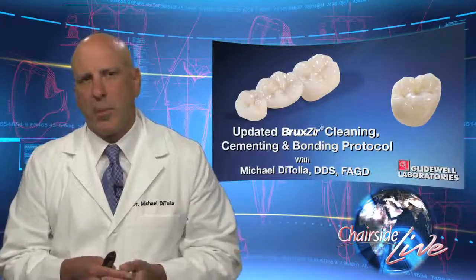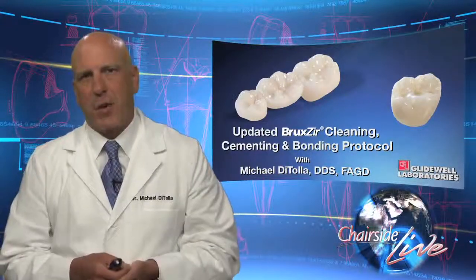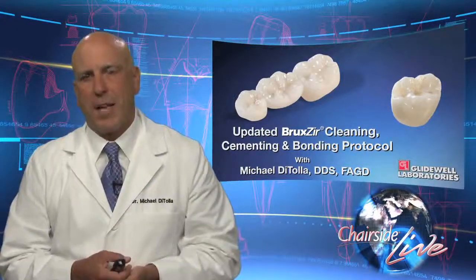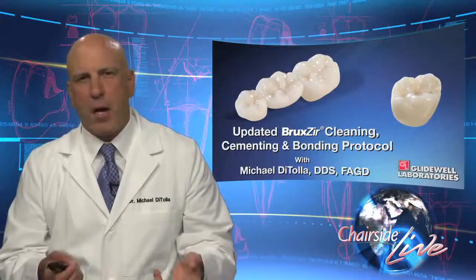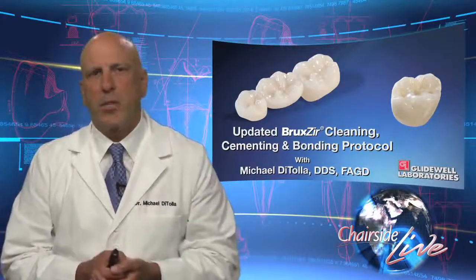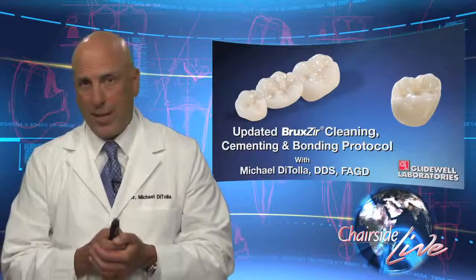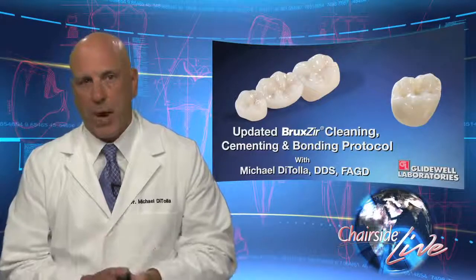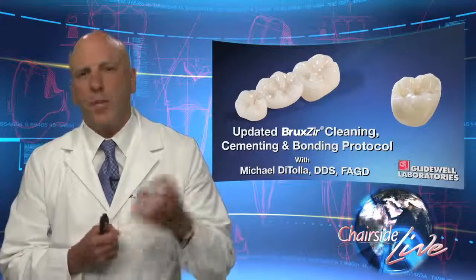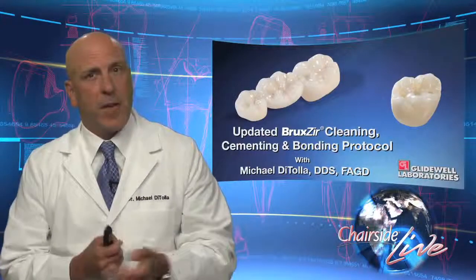This applies to all of them, not just to BruxZir. There's something different that goes on with zirconium oxide. When you get a BruxZir crown or a zirconia-based crown back from the laboratory and try it in the mouth, it's almost impossible to try it in without getting some saliva on the internal surface of the crown. And as it turns out, the only thing that really reacts with zirconium oxide is phosphate groups.